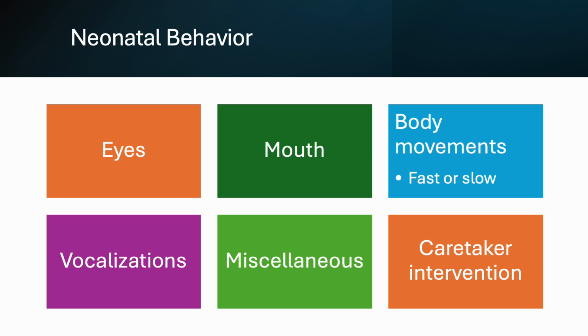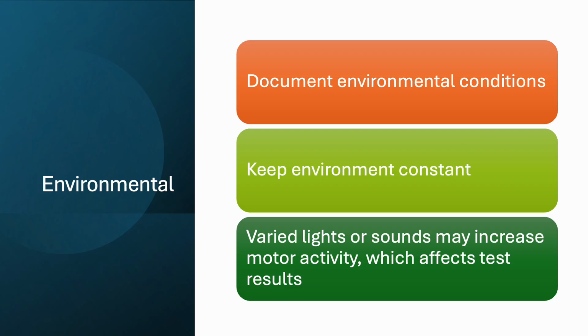What if something happens to the video and it gets deleted for some reason? That happens. That's why it's a good thing to document everything the patient and caretaker does. Also, if there's abuse, you have evidence of it. Try to keep the environment in the patient's room the same, meaning don't change rooms on the infant if something's not working. Put them in a room that you know is working already and you won't have to disturb them.